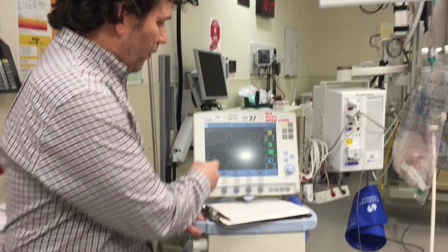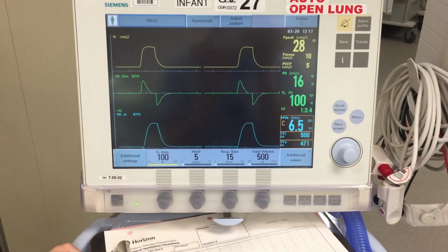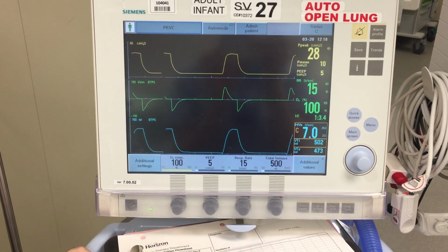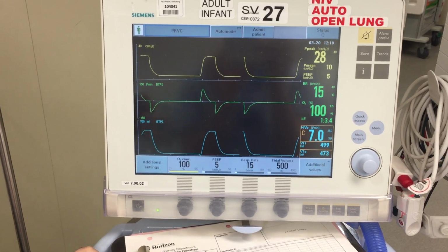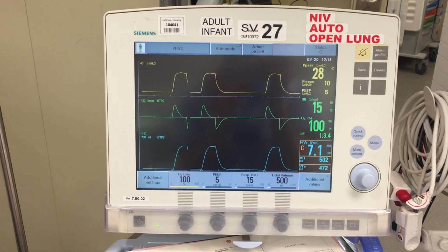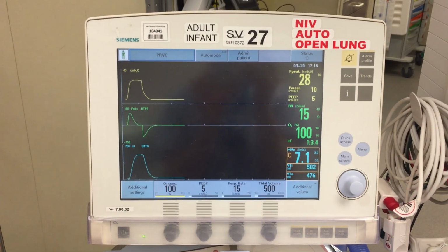Our FiO2s are always usually set at 100, and with that we would certainly increase our PEEP accordingly to achieve the oxygenation that you would like for that patient. With these patients, the research I have read says you're going to be looking more like PEEPs of 20, 25, probably may not be in emerge, more in an ICU setting. But if you need to increase your PaO2, and you're already maxed on the FiO2, then certainly going up on your PEEP is what you're going to need to do.